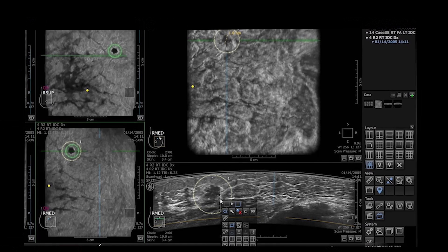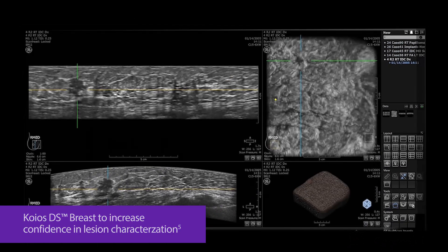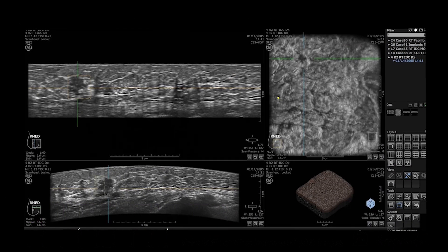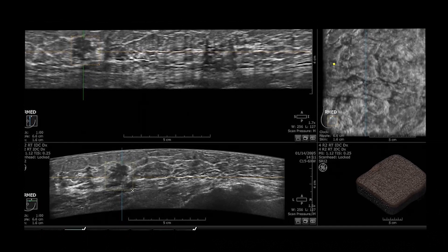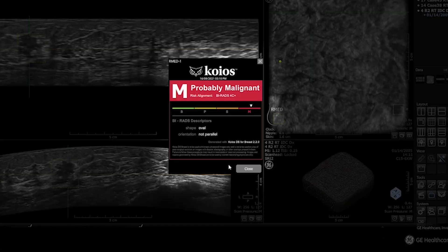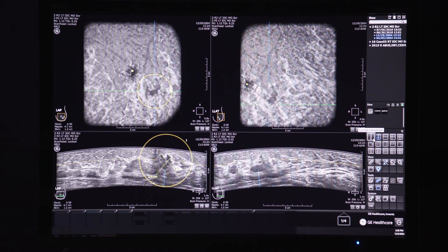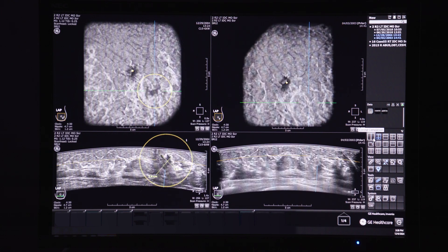If further evaluation is needed, Koios DS Breast can support in lesion characterization by providing the likelihood of malignancy using the ACR-BIRADS classifications to help proper decision-making. The auto-prior compare feature mimics screening mammography workflow with the ability to save and compare priors for repeatable and reproducible longitudinal study comparisons.